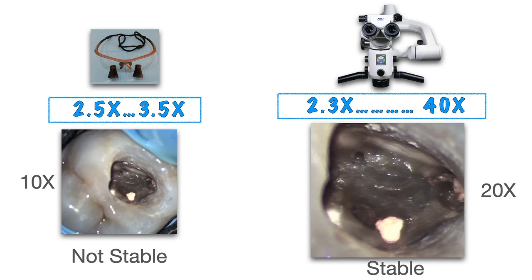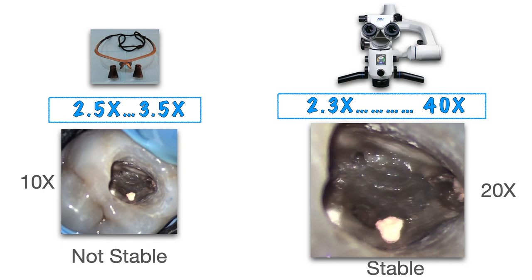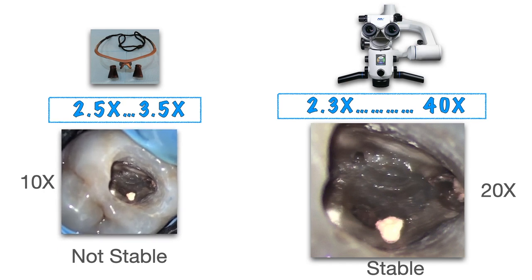But the other problem, which I found in my practice, is that when we use more magnification, we face the problem of heartbeats. When we have a heartbeat, we feel that the picture has a movement, and we are not able to control that.